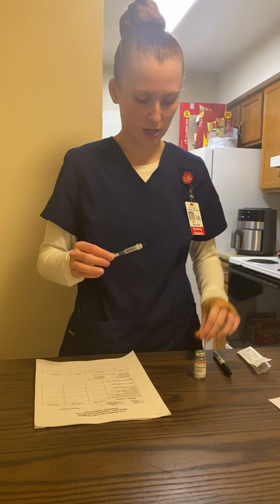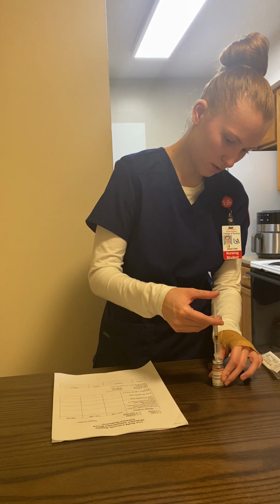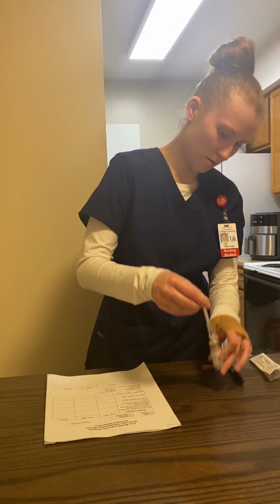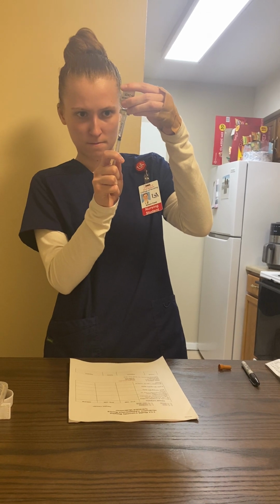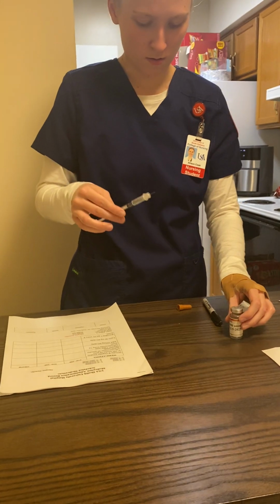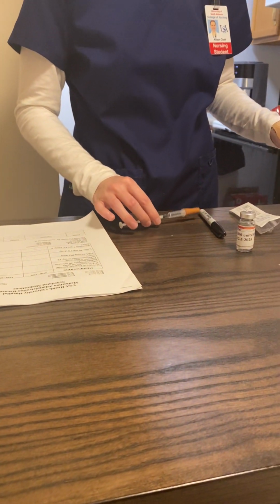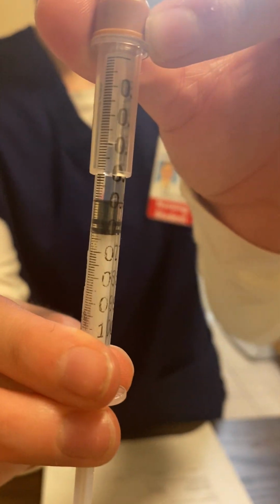I'm going to carefully take the cap off, stick the needle in, inject the air, flip, and withdraw half a milliliter. Now I'm going to carefully recap. And we have half a milliliter of heparin.